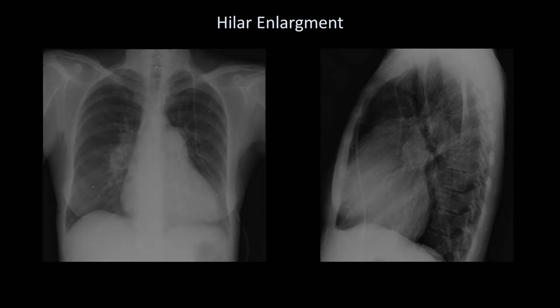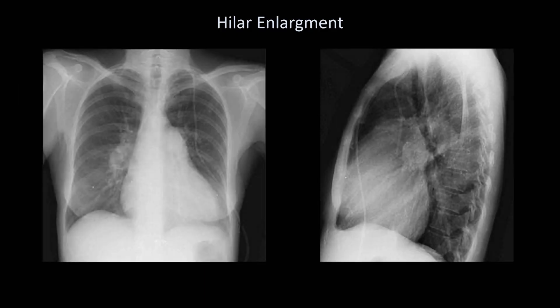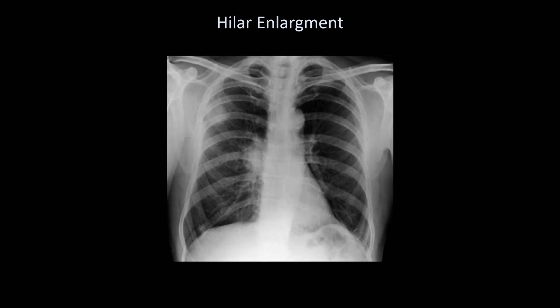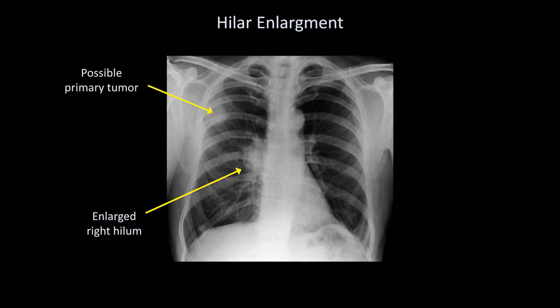Here is another example of hilar enlargement — in this case, the patient had severe pulmonary hypertension. In this next case, there is unilateral right-sided enlargement, unfortunately associated with an opacity in the right upper lung that looks suspicious for a primary tumor. Overall, the most likely diagnosis here is a primary lung cancer with a hilar node metastasis.